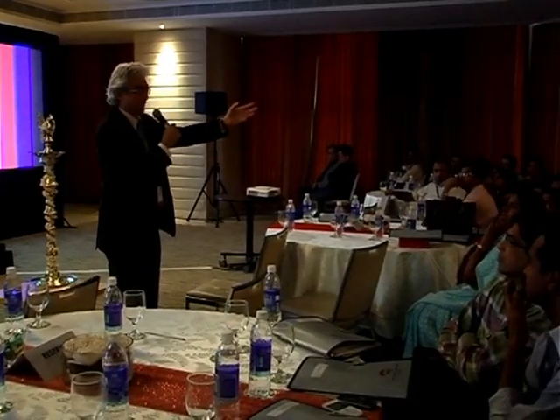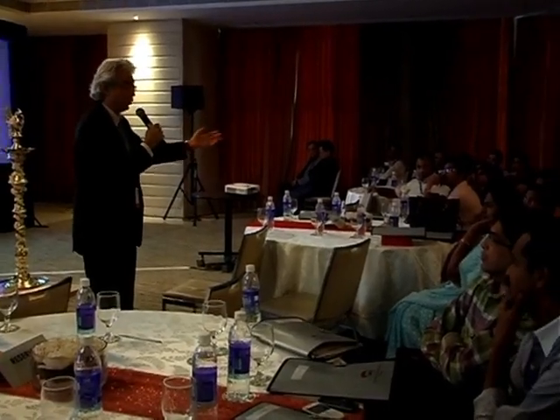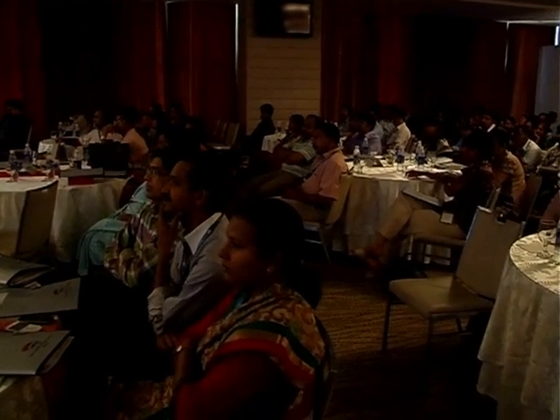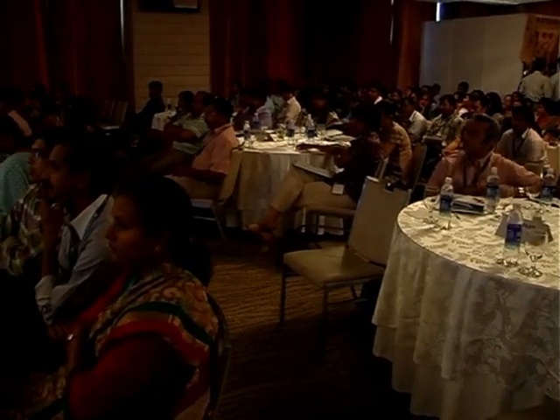You can also use your tactile sensation, but that's not as accurate as you would want, but the Diagnodent would be more accurate. If it's reparative dentine, you can see the difference in the color, and you have a feel. But if you're in the slightest of doubt, get that layer out. It's as simple as that. But the Diagnodent will give you a good reading.